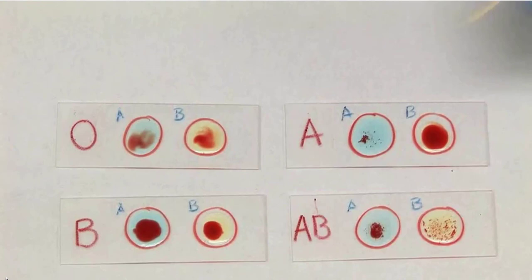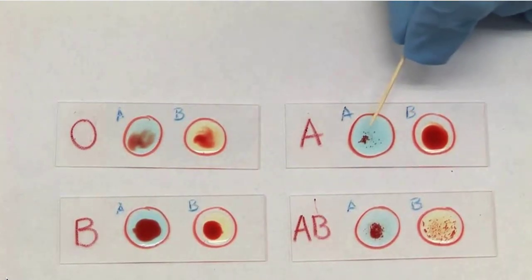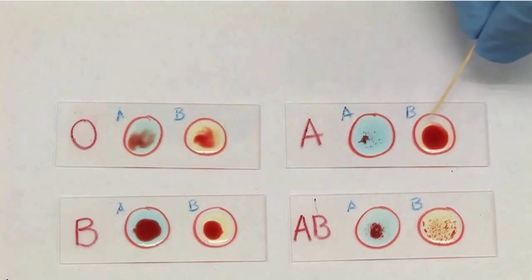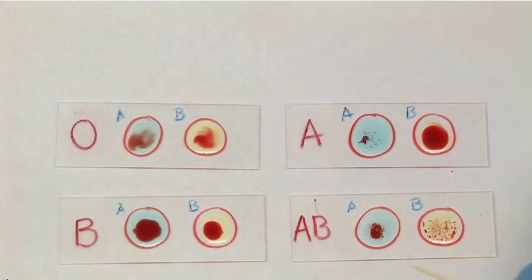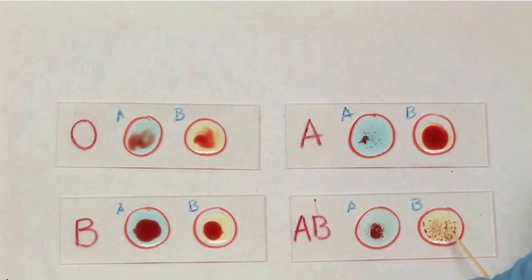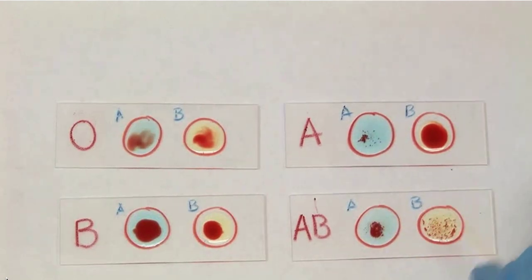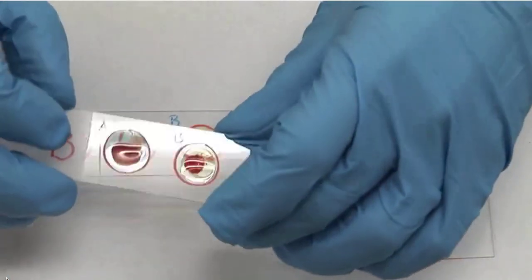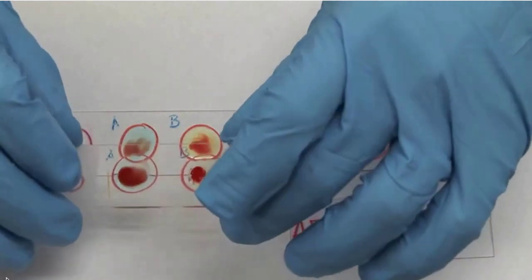For the person who is labeled type A, you can see agglutination or clumping in the antiserum for A, while there is no agglutination or clumping in the antiserum for B. For the person labeled type AB, we have clear clumping or agglutination in the antiserum for A and the antiserum for B. And for type B, we're going to make a little more mixing here just to make it more clear.